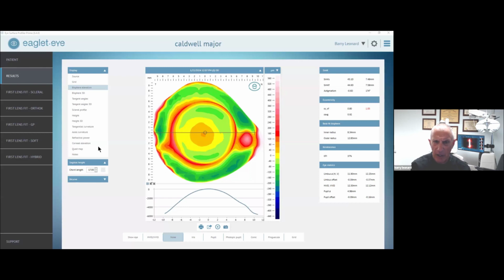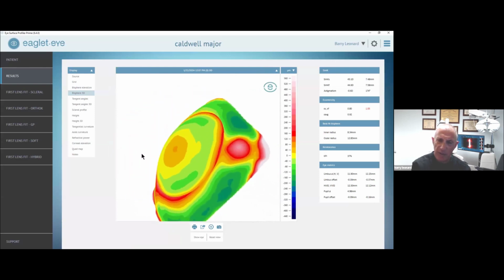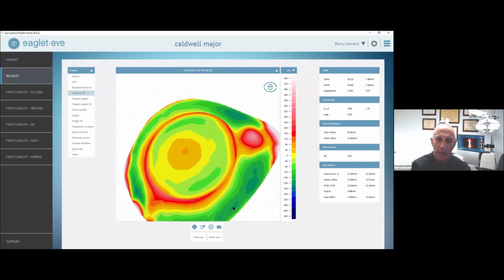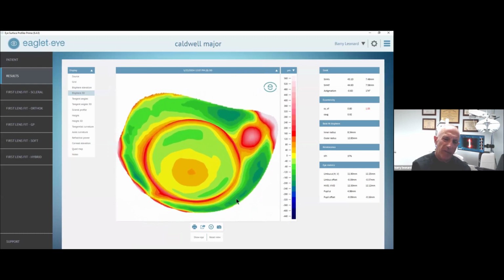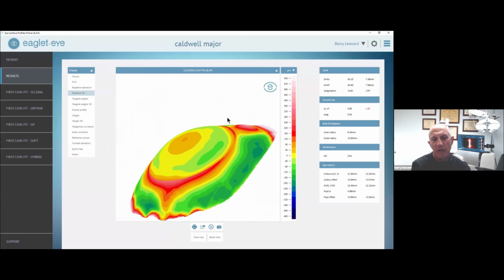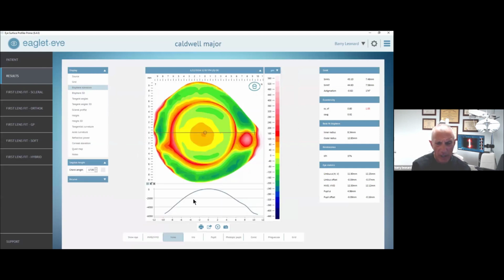And so we're going to get our scleral profilometry. And from that, the big thing is just this. I just sit there and show them this 3D model, and they start to understand what they are up against. And even the ones that come in here that have known they have keratoconus, have been fit elsewhere, and this or that, when they see the 3D model, and also we can then show them the elevation line drawing here, and you can even see that little bump from the pinguecula there.